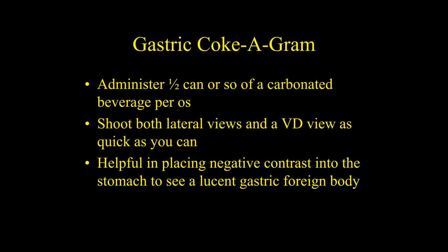If you remember from our lecture talking about the stomach, we play with the stomach bubble, okay? So if you have the dog in right lateral view, the gas in the stomach is going to float up into the fundus, and you're going to have fluid in the pylorus. On the left lateral view, it flips around the other way. The whole idea here is, if we have something that's stuck in the stomach, typically in the pylorus, and we put gas around it, that's a different radiographic opacity than ingesta or a foreign object in the stomach. If we put gas around it, we might be able to see it.